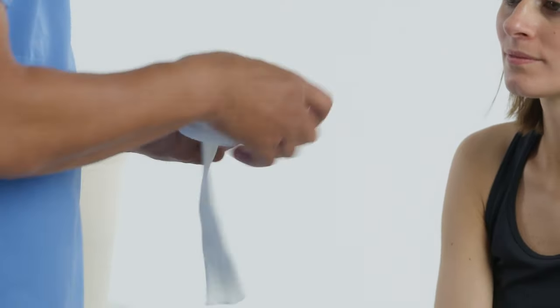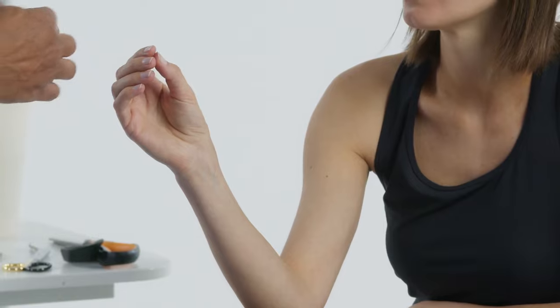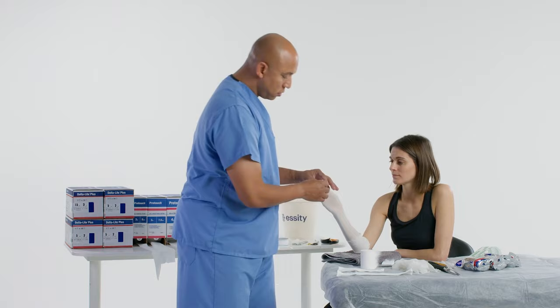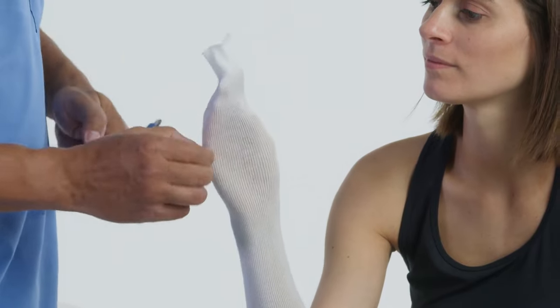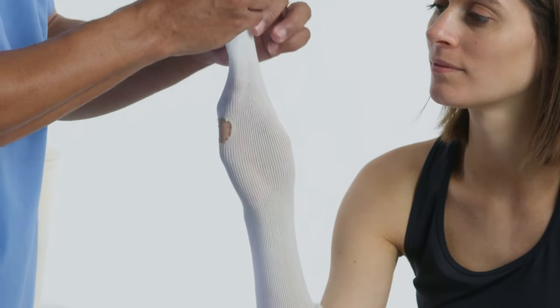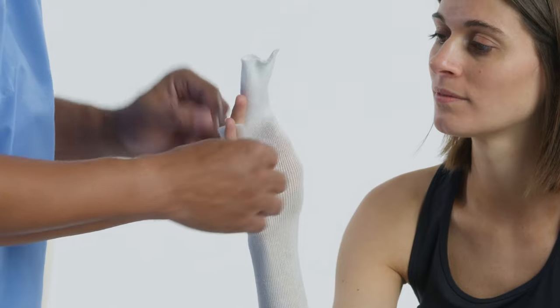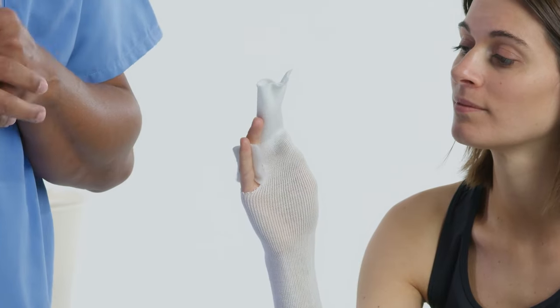Now let's put the stockinette on. Once the stockinette is on, let's do a series of different cuts — pull this aside, make a small cut, slide this up and then slide it back down. Now let's put some padding between the fingers. You don't want it too far, sticking out past the tips of the fingers, where you can't actually see the fingertips for a blanch test or capillary refill.